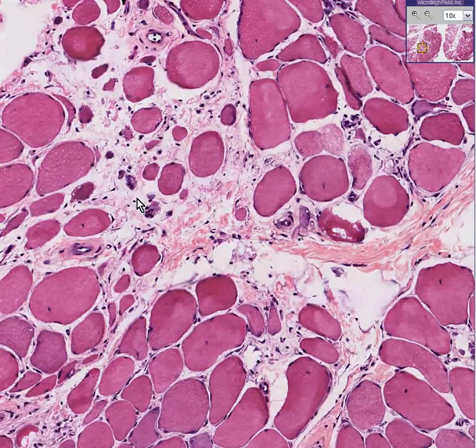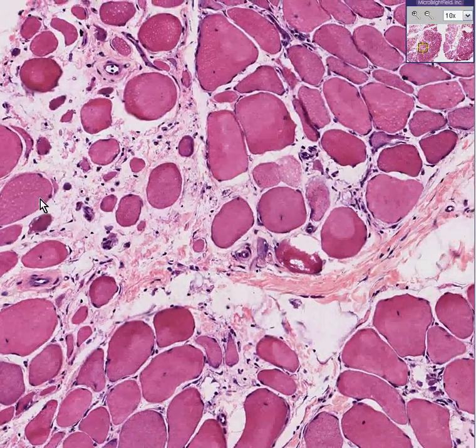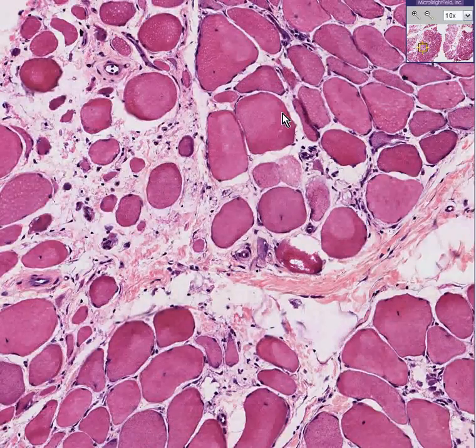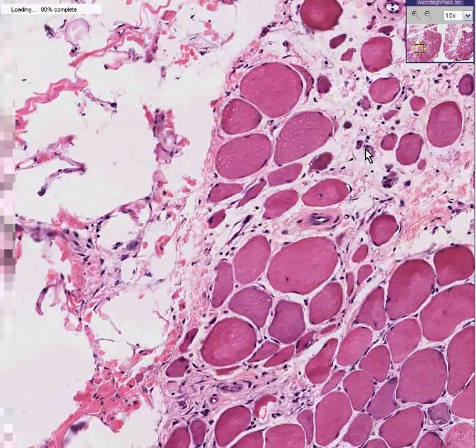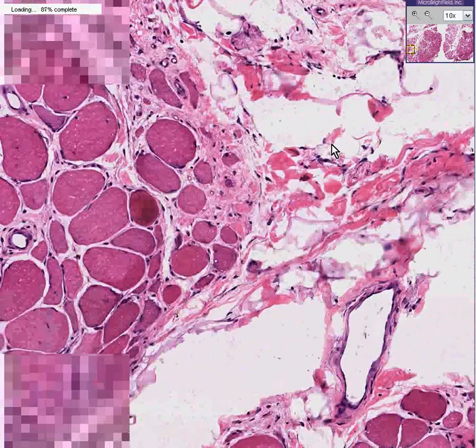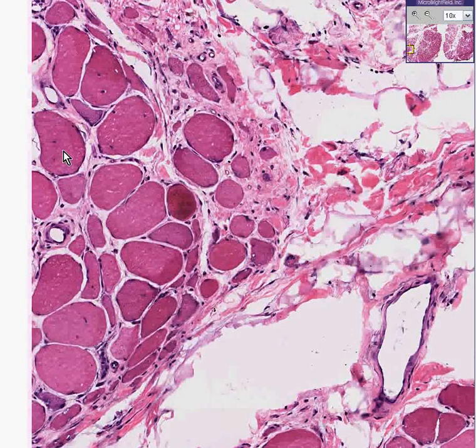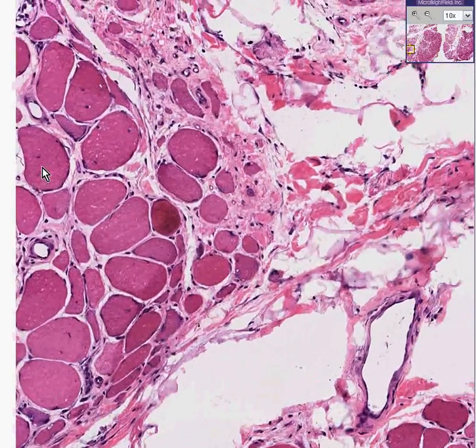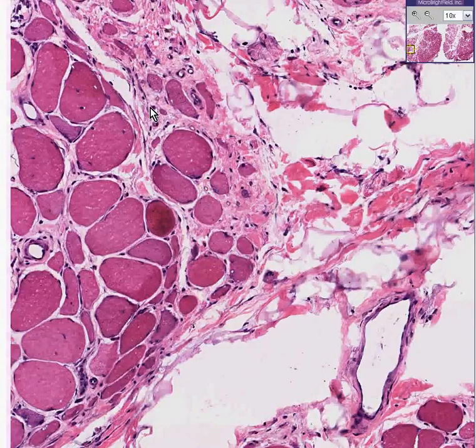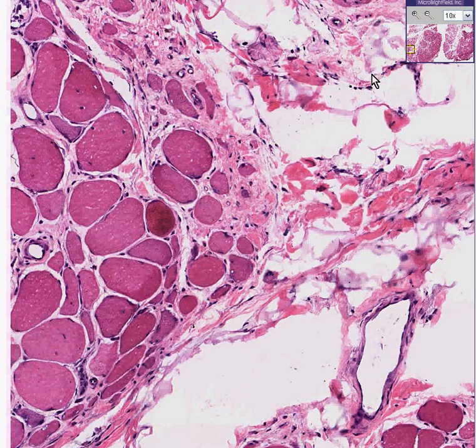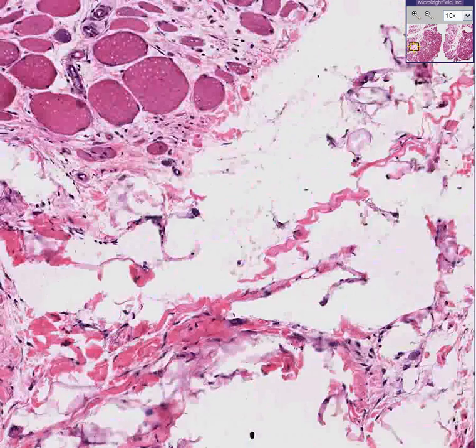This is a common finding in many types of primary muscle disease in which the muscle fibers start to drop out. Even with denervation, for example, some of the adjacent fibers may appear to hypertrophy. So this is not simply a hypertrophy of muscle, although some fibers are hypertrophic. It is not simply an atrophy, although many of the fibers are atrophic, small, dropped out, and replaced by fibrous tissue — or, as the disease progresses, fat. This is muscular dystrophy.